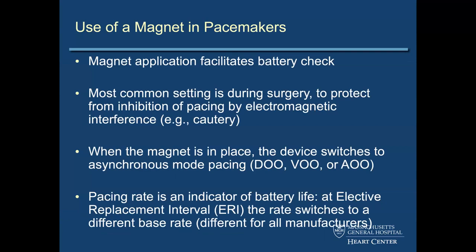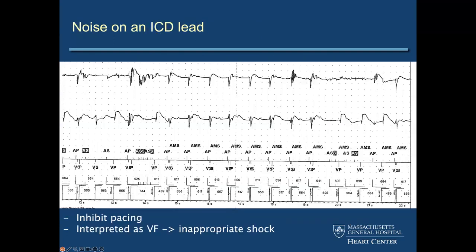And Dr. Ptaszek, do you mind staying on that one just a second? Do you mind going back to that image? Go ahead. This is kind of an interesting example. So this is an Abbott device, I would say. It's an older one, but it looks like the Abbott layout here.